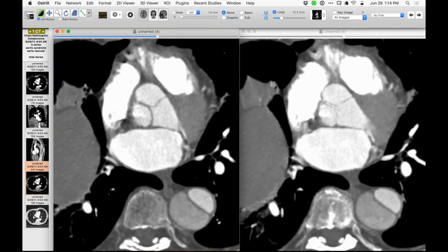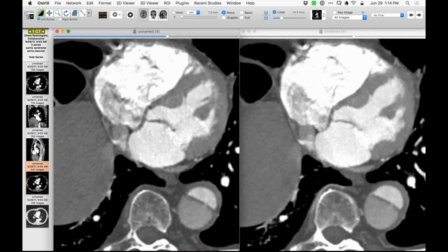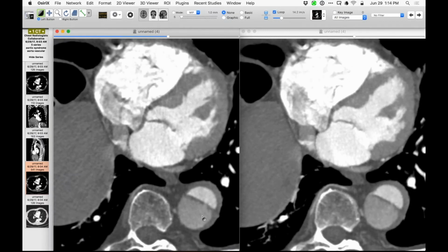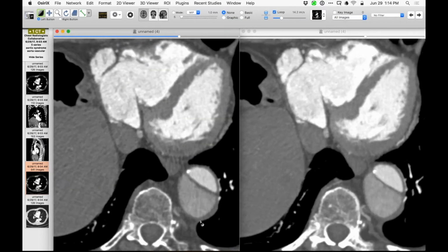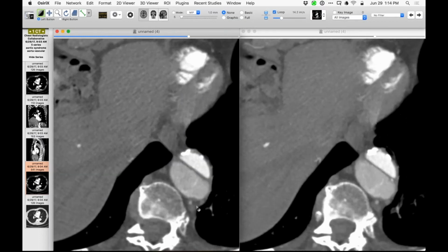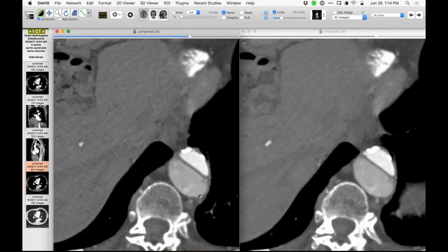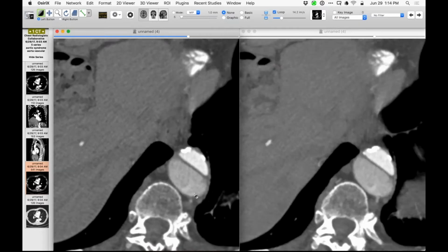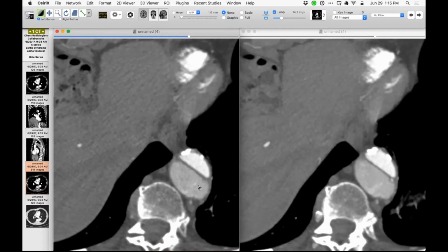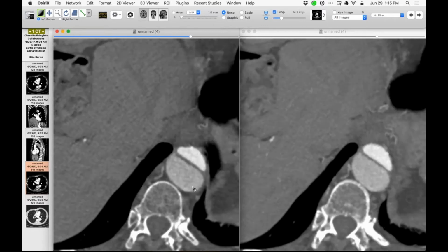Yeah. And then I thought I may have seen another, a little harder, but I wondered about there. Maybe, no, there may be a little jet trying to get through. I'm not sure about this one right there. But I get the idea that I'm seeing tiny, tiny fenestrations through which there are squirts of contrast opacified blood popping into that false lumen.